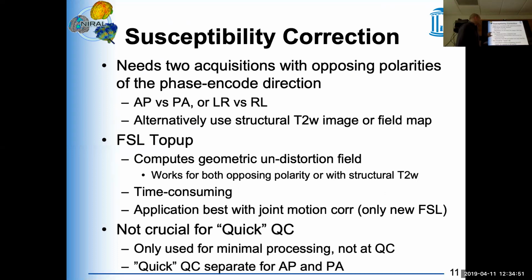I always hesitate to use FSL top-up for our old pipelines, because the old FSL was not able to do this. And we know we have always motion in our data. So then I just basically do not correct for it. I'd rather accept that my DWI image is imperfect with respect to its geometry. But that's better than correcting the geometry, but doing so incorrectly.